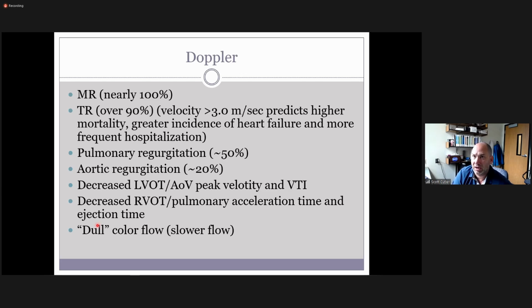Seeing the valves is kind of in between a primary and secondary, because we do need to prove that it's not a valvular cause. So we need to show the valve functions in that. I'd still kind of throw that into secondary things with it, particularly regurgitation. And then anything showing the pressure elevation and things like that. But primary, first thing that you do on a dilated cardiomyopathy, show me all the views of all 4 chambers and show their size with their measurements. That's like the main thing. And then beyond that, we're going to show the hemodynamic changes of it.